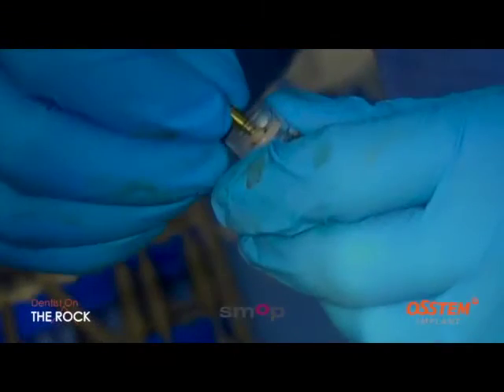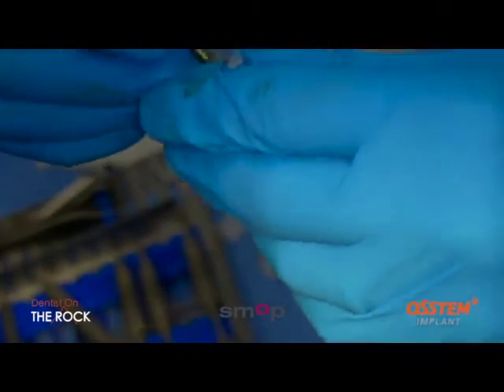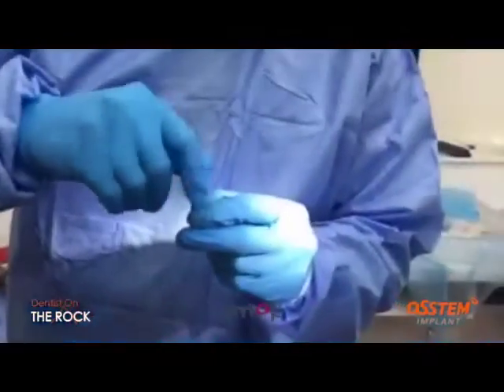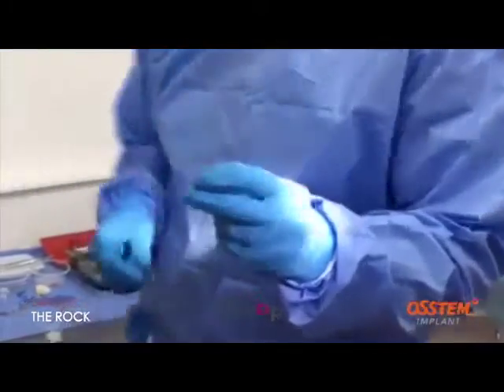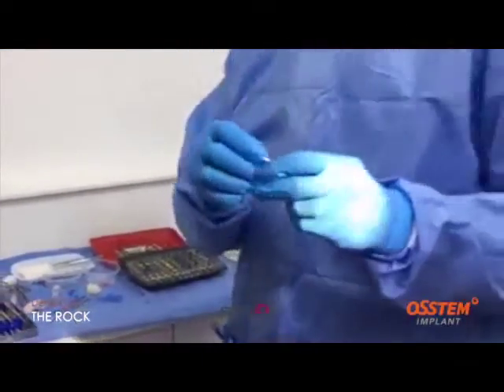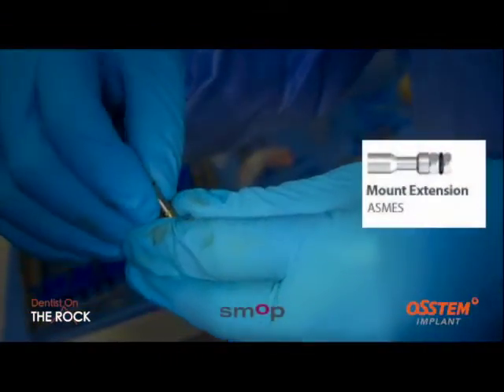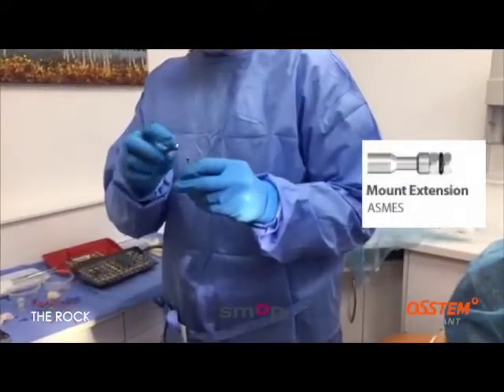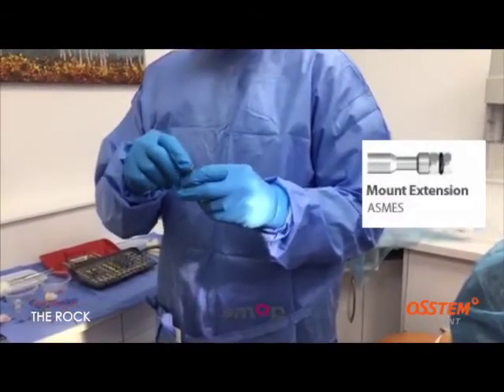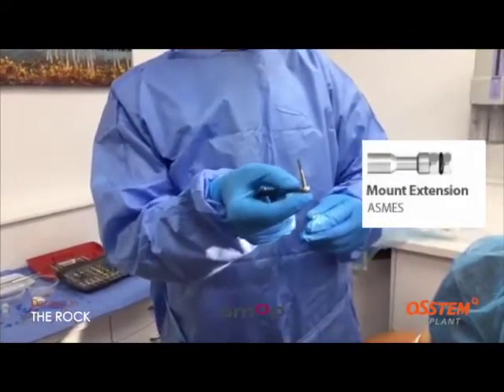Just gently let it rock into place. There we go. And then the screw just pops into place nicely. And then use just a normal mount extension as with any of the guides. So then we connect the torque wrench, and that's it picked up. Lovely.